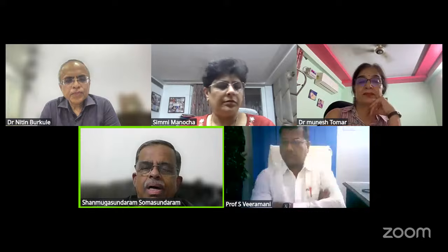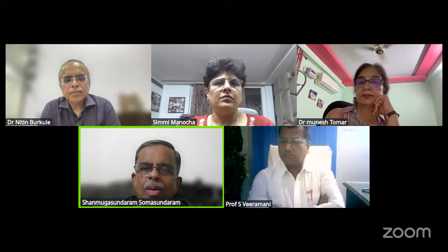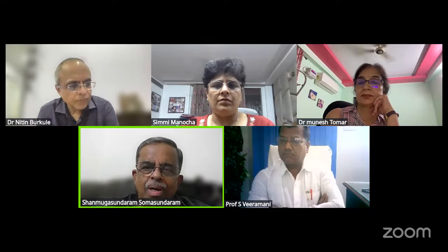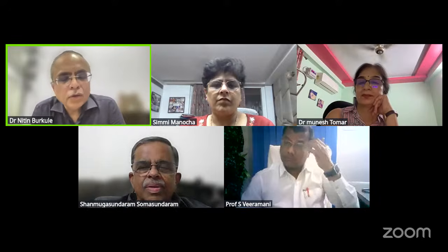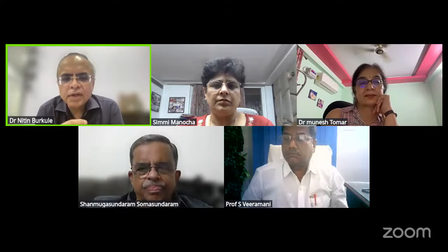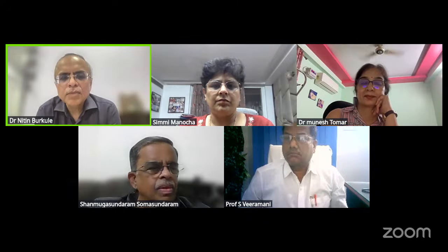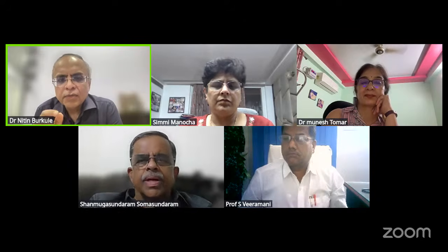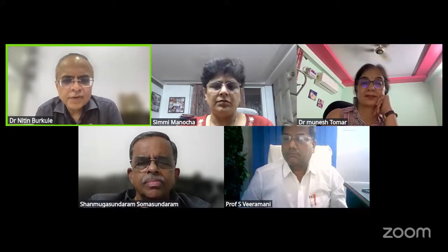You mentioned slice thickness has to be more to have a better resolution. Is it right? I was under the impression that slice thickness should be less to have a better resolution. No, the thing is, the noise level is reduced when the slices are thick because you get a composite signal. But as the slice thickness is less, obviously you will have the best resolution. So you want the smallest voxel as much as possible. But if you go for the smallest voxel, the noise level also goes on increasing. So there is always a trade-off.